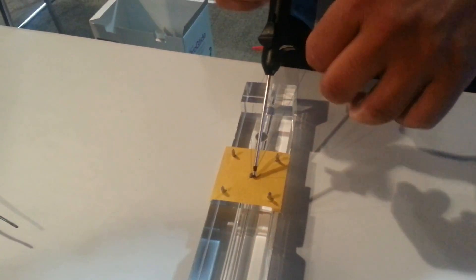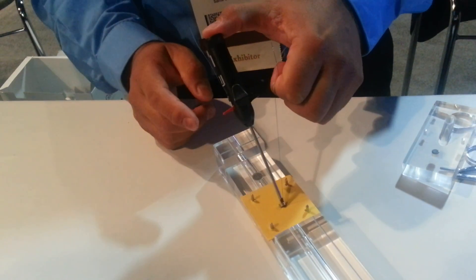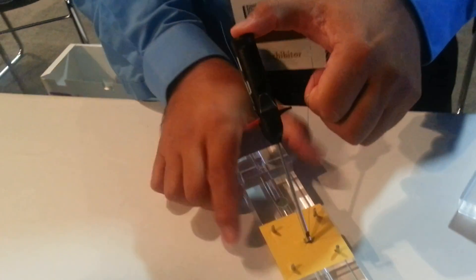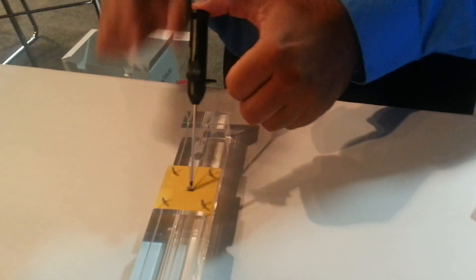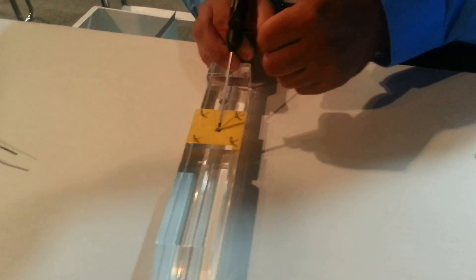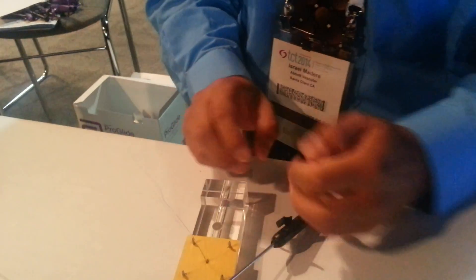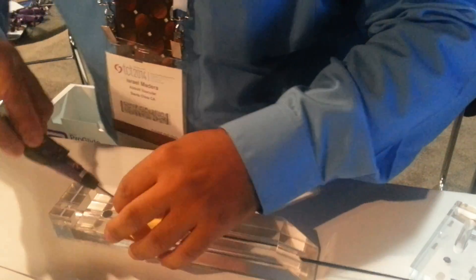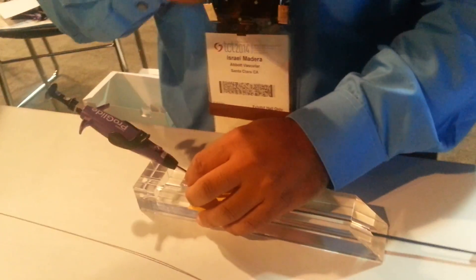Now with one hand, I'm going to put my finger like this. This is on your left hand. So you make traction on the long wire and you push — one hand. The reason being is you're going to pull — what you want to do is you want to pull on the suture, not push.